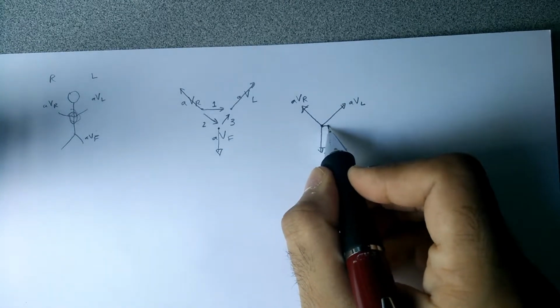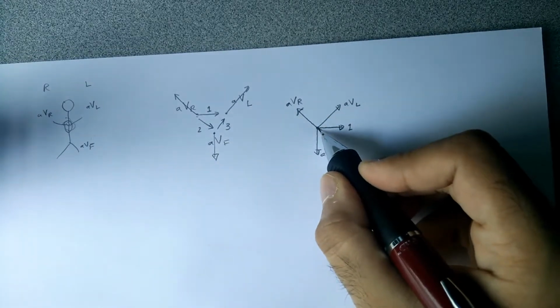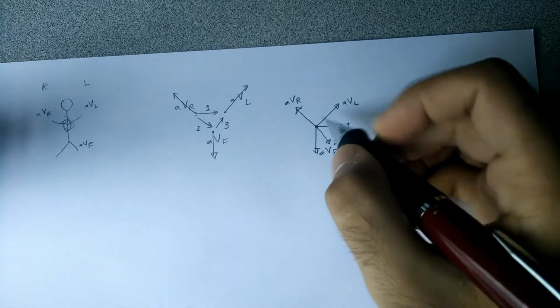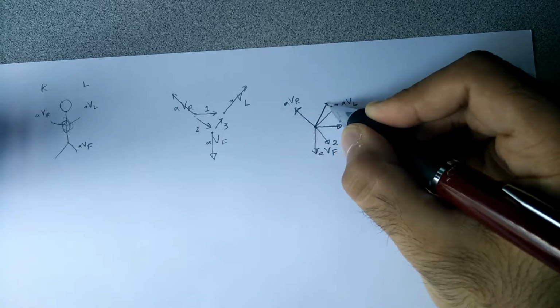Then we can draw lead 1, which we said goes in this direction. We can draw lead 2, which goes in that direction. And then we can draw lead 3, which goes in this direction.